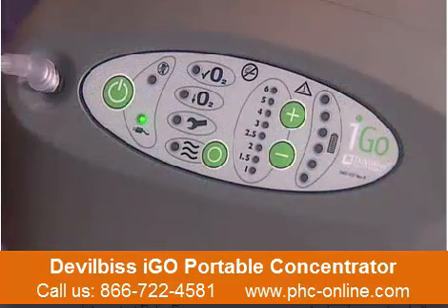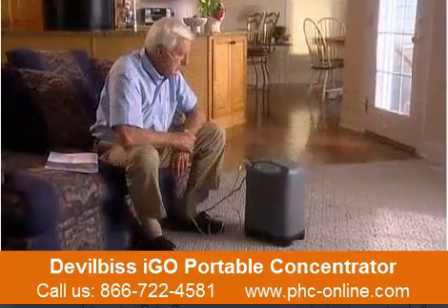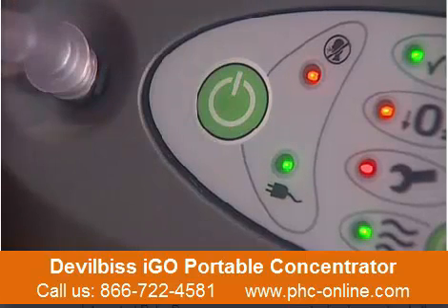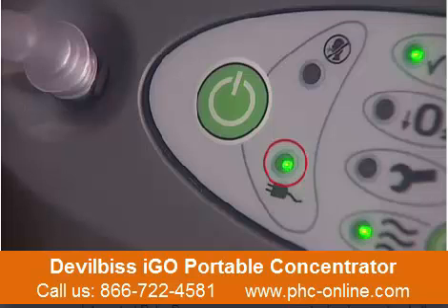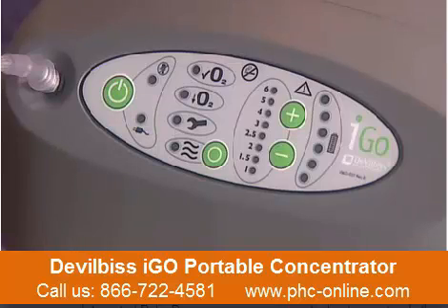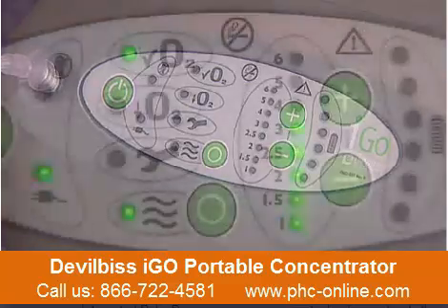The iGo system has been designed to simplify operation from its intuitive top-mounted control panel. Simply press and hold the power button located here to turn the system on or off. The external power light illuminates when the iGo system is connected to either AC or DC power. If there is a power failure without a charged battery installed, an audible alert will sound and the light will flash for 15 minutes. Pressing the power button stops the alert.